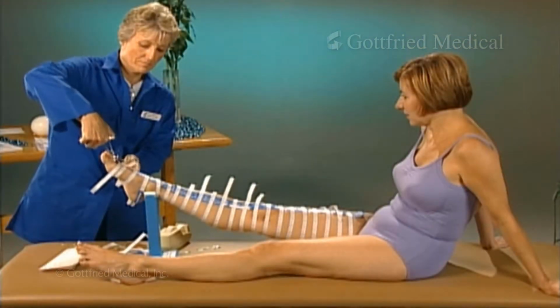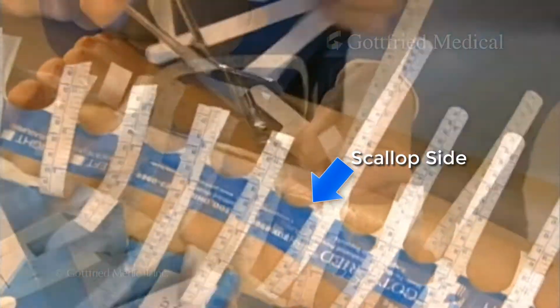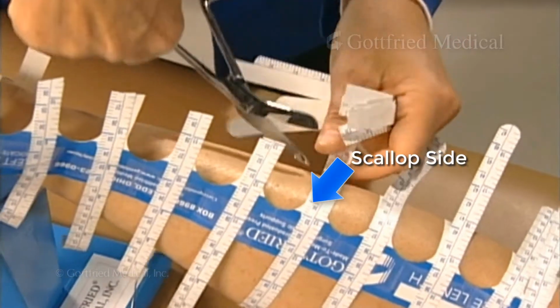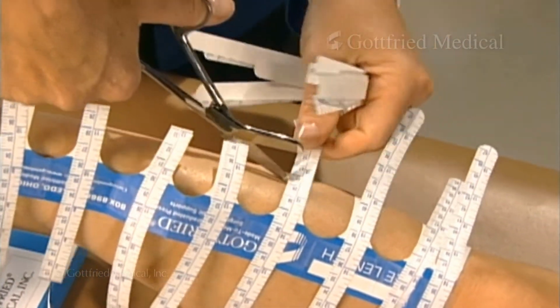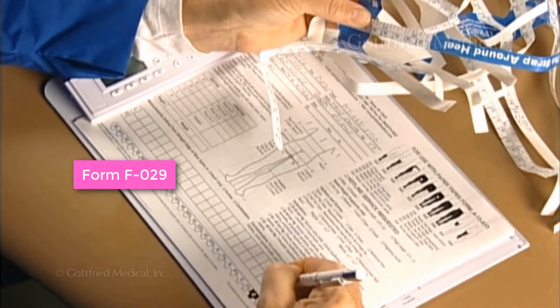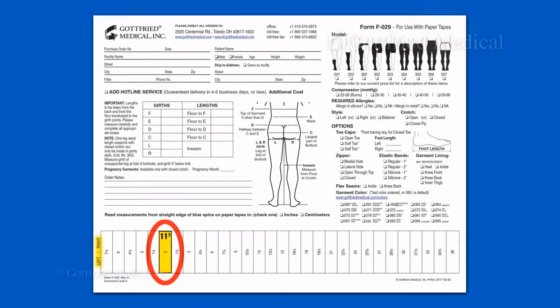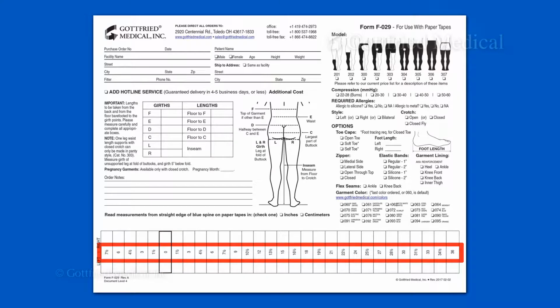To remove the tape, cut the straps on the scalloped side of the tape spine, below the strap identification numbers. You can either enclose the tape with the order form or record the measurements directly on the form. Take the measurement from the straight edge of the tape. For example, the circumference of the heel at the 0 strap measures 11 3/8 inches.